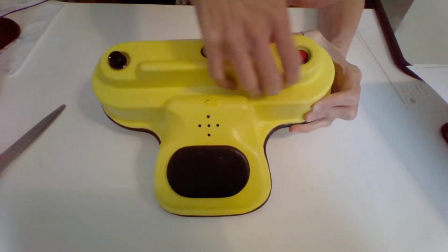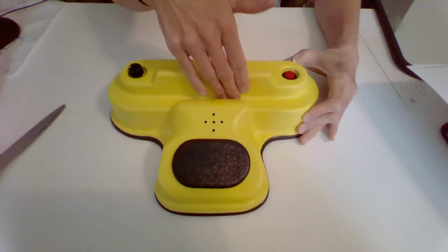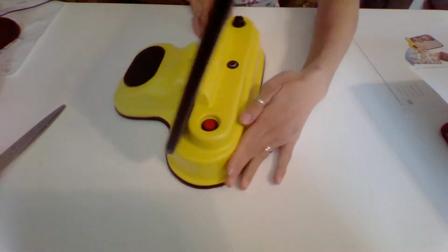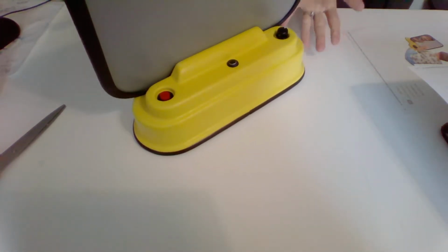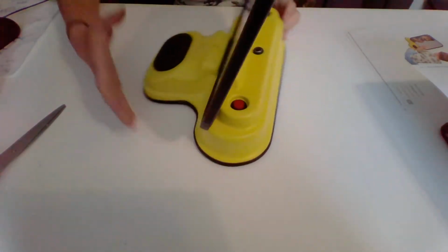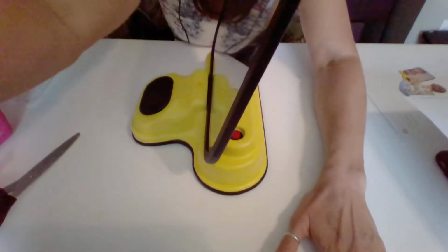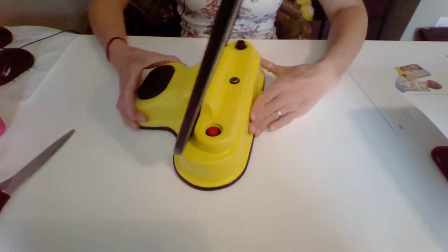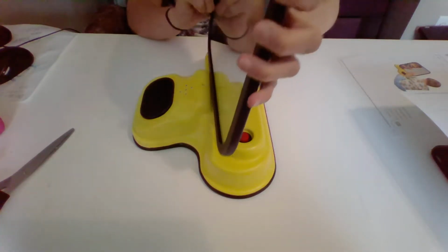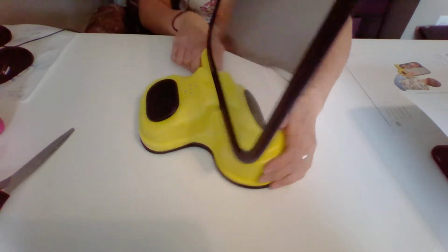There is a little tray right here. This is a tray that holds the mirror. So that's kind of nice. If you set in the mirror and turn it sideways, you can see it's actually holding the mirror on its own, hands-free. Yay. That's a nice feature, right? I'll put it up a little so you can see it a little better. There you go. There's nothing you have to attach it into. It just literally sets right in there. And it's pretty tough too.